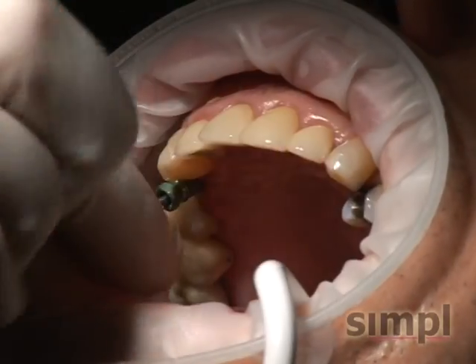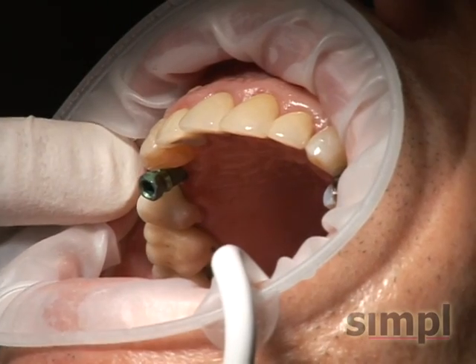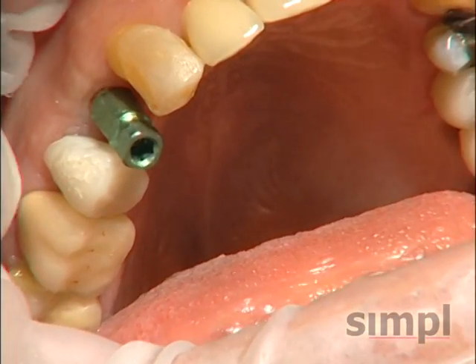Putting on the impression coping. This is a Zimmer regular platform. It's all the way tight. We're going to go ahead and verify that it's seated completely with an X-ray.